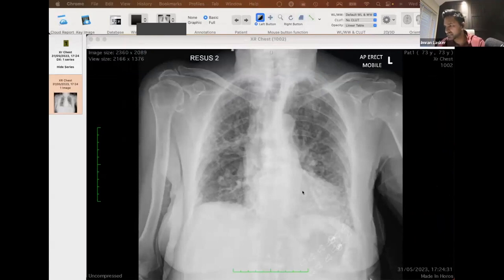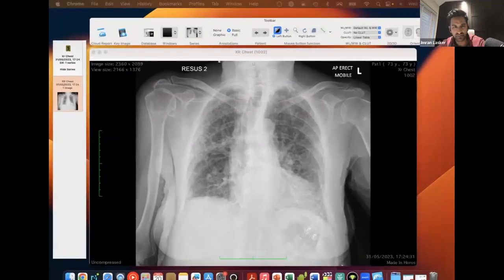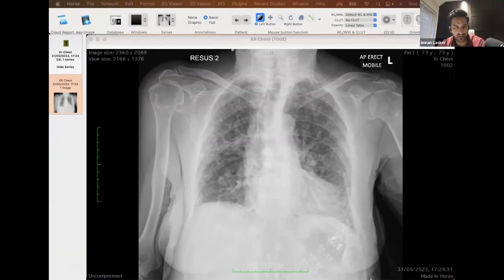Okay, so let's have a look at this one. Yeah, interstitial lung disease. Can you mention which case you're opening so we can follow ourselves? Yeah, I wish I could, but there were a few issues going on with the platform itself, which is why I'm presenting it off my computer. I don't know if anyone from Collector Minds can give me an update. Let's see.